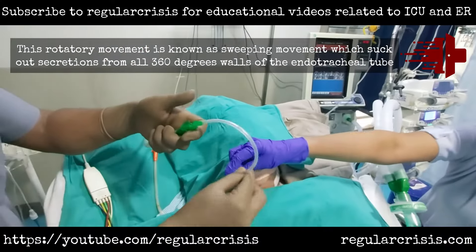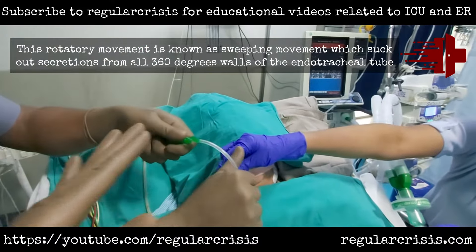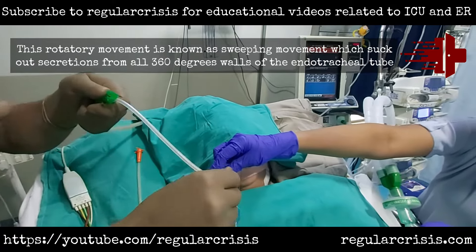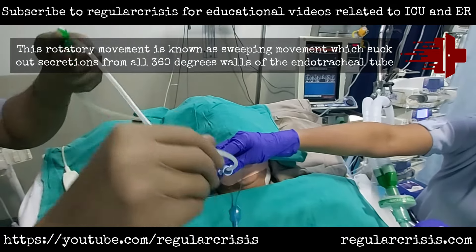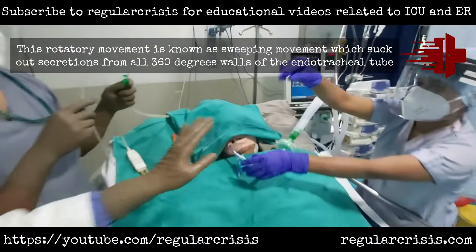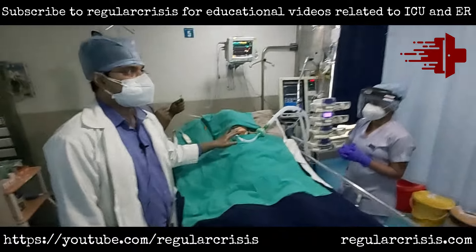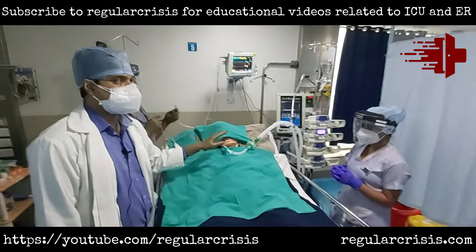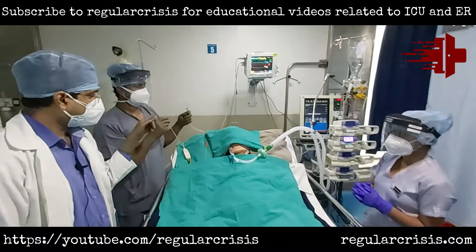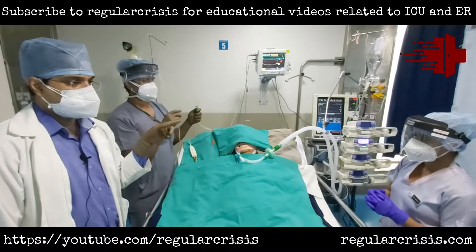Disconnect the cath mount, go inside without applying suction — stop at the correct depth. Then close the thumb and withdraw with a rotatory movement. Allow at least 30 to 40 seconds for the patient to be ventilated again before the next cycle.